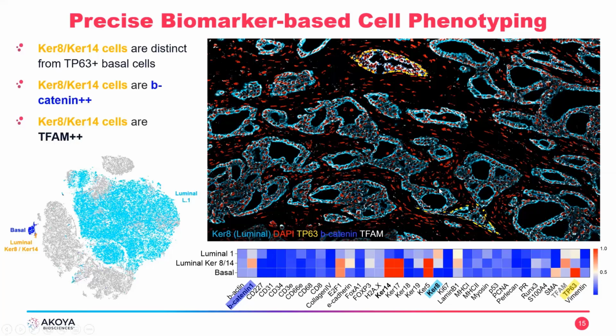You can click, unclick any marker you want here, and you can ask whatever question you want at whatever zoom value. Remember, we're just looking at a fraction of this entire tissue piece, and we're really only looking at 4 or 5 markers right now. This tissue is another 20 times larger, and there are 36 markers. So there are many, many questions to be asked and answered.